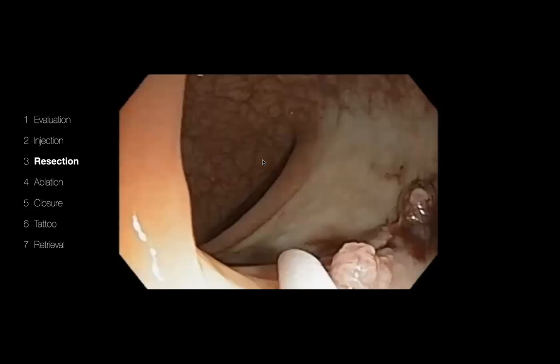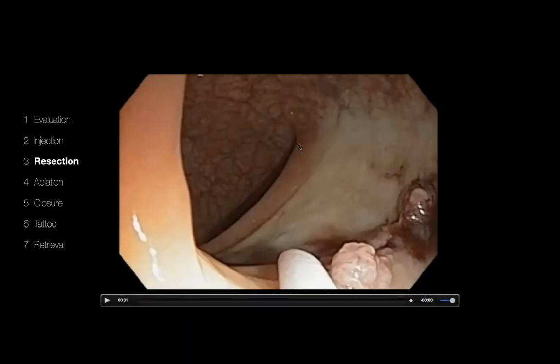And because the polyp is still there, residual polyp at the edge, as you can see here, I basically closed the clip and told my assistant not to deploy, and waited for 5 minutes. We said, let's sit tight here for 5 minutes to apply tamponade and for the clot to form, so that I could reopen the clip and then deal with the residual polyp and then close the defect. So that was my thought process. And interestingly, after 5 minutes of closure and reopening the clip, there was no further bleeding.